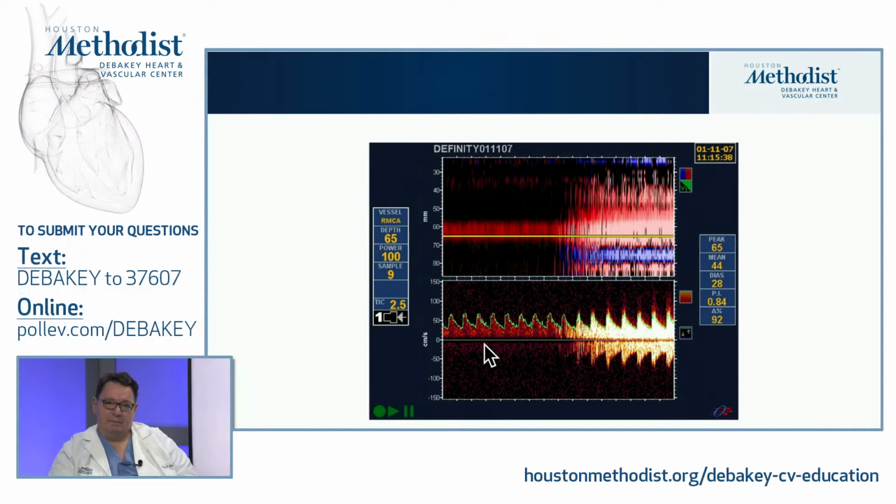You only see the MCA velocity. I am at the MCA-ACA bifurcation, and I started to see even the ACA here. So that is the beautiful contrast, what your M mode is showing you, but also showing you what is the spectrum showing above, positive, and here's your negative signal here.